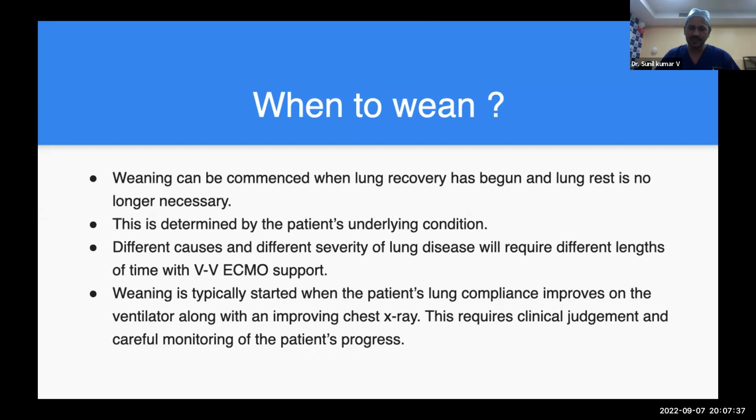Weaning is typically started when the patient's lung compliance improves on the ventilator along with an improved chest X-ray. And this requires clinical judgment and careful monitoring of the patient's progress.